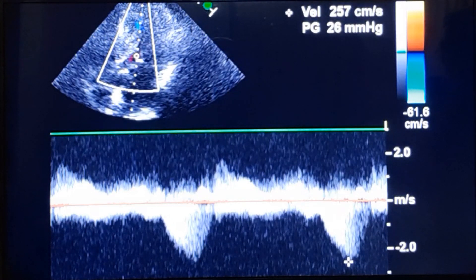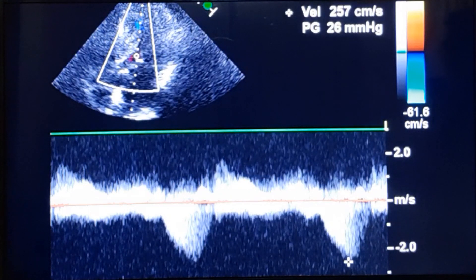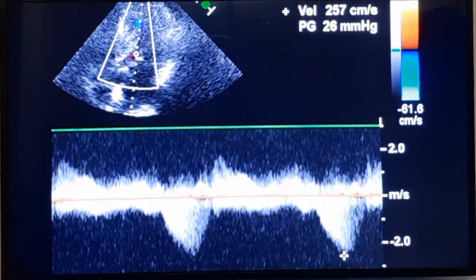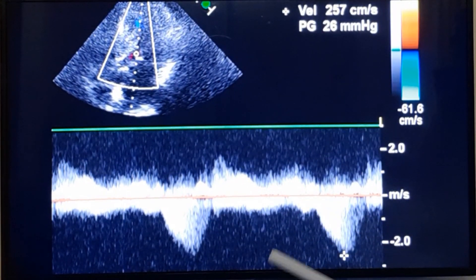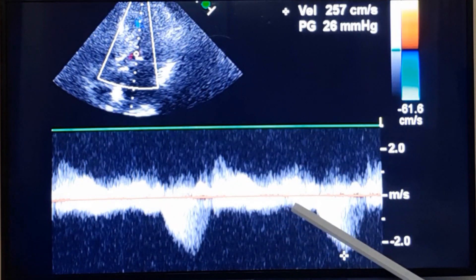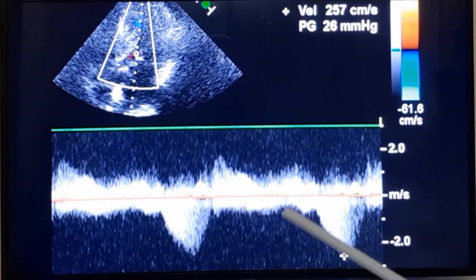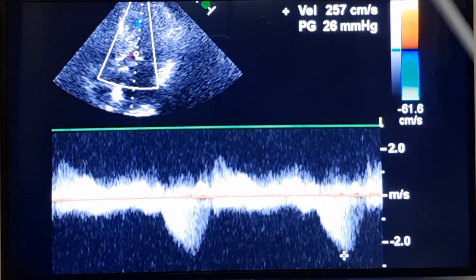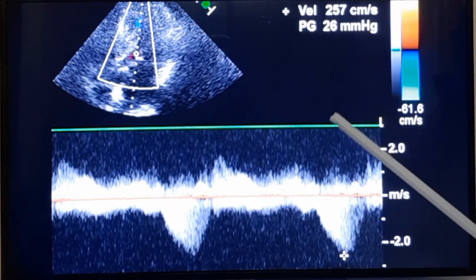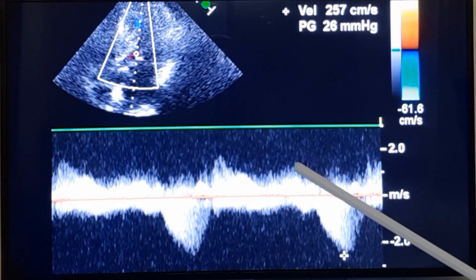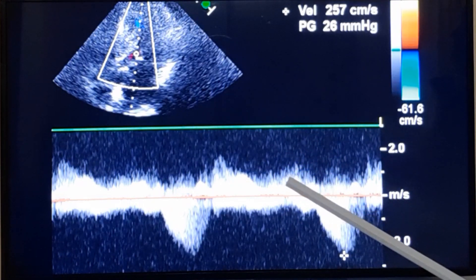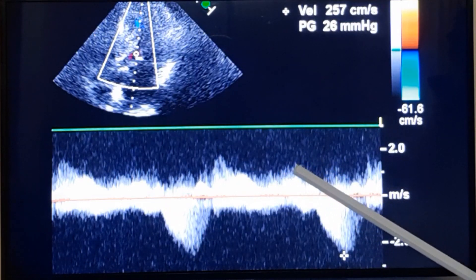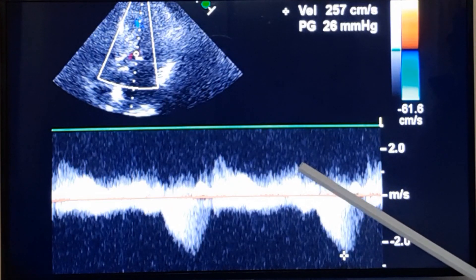The gradient can increase or decrease with various maneuvers. When the gradient is low, you can increase it by provocable maneuvers like Valsalva maneuver, isometric hand grip, or standing. It may be difficult to record a good echocardiogram during these maneuvers due to transducer position changes, but it is still useful — this gradient of 26 might increase to 60 or 70. During standing, venous return decreases and left ventricular volume decreases, which is why the gradient increases.